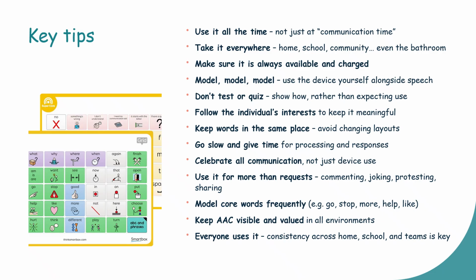Model, model, model. Use the device yourself alongside speech. So it's mostly that the adults will begin to use it rather than the child, okay? Don't test or quiz, okay? So show how rather than expecting use. Please don't be saying show me where it is, because that's quizzing and it doesn't build up a good relationship for the child and the device. Follow the individual's interest to keep it meaningful. Keep the words in the same place. Avoid changing layout. So the speech language therapist will have set it all up for you, keeping in mind how many boxes per page, etc., to try and keep it in the same layout.